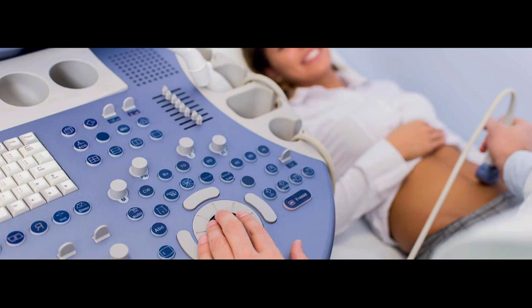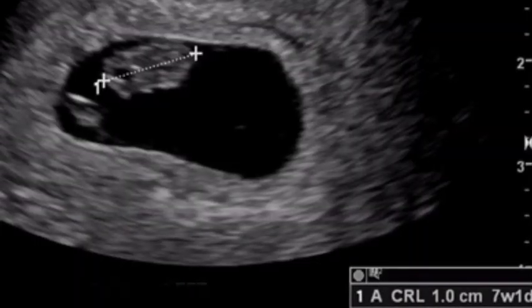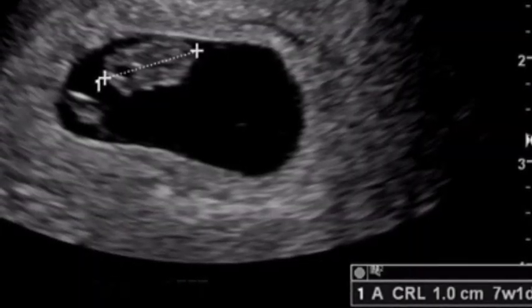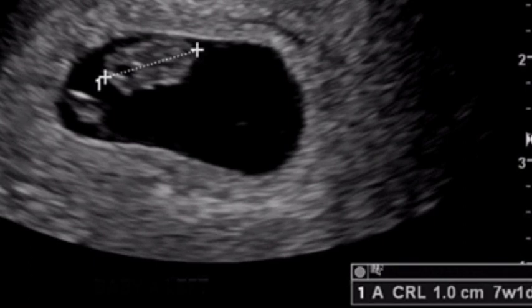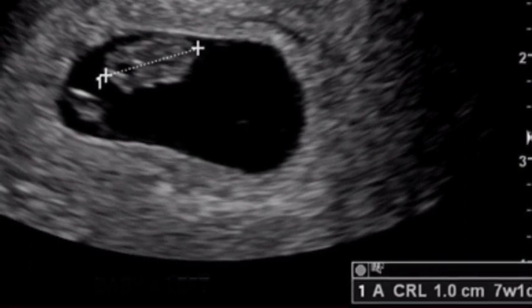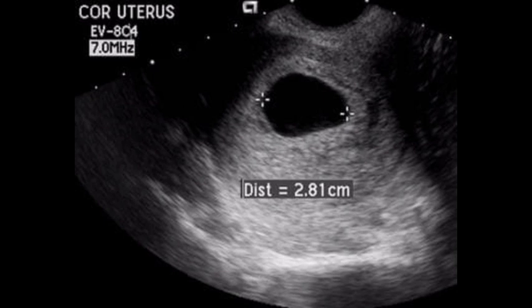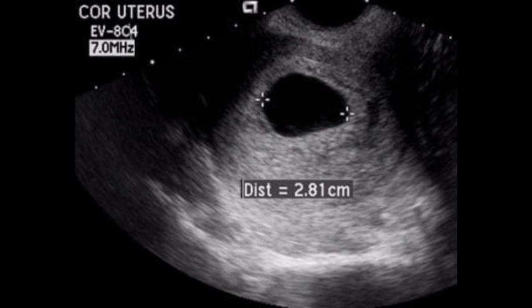Findings diagnostic of pregnancy failure will include: 1. Crown rump length of greater than or equal to 7 mm and no heartbeat on a transvaginal scan. 2. Mean sac diameter of greater than or equal to 25 mm and no embryo on a transvaginal scan.